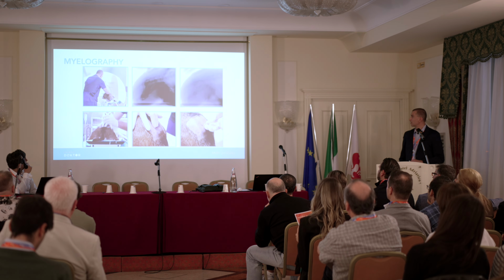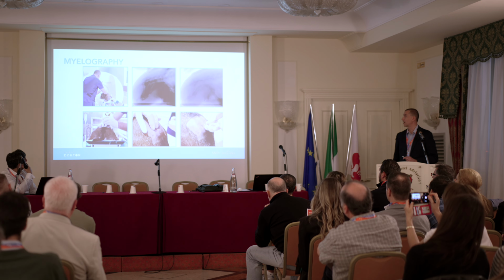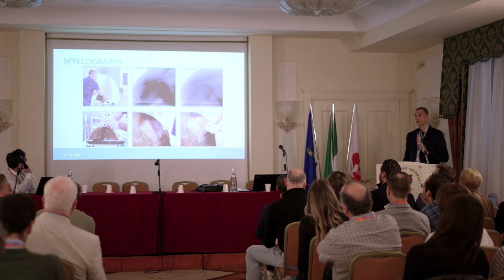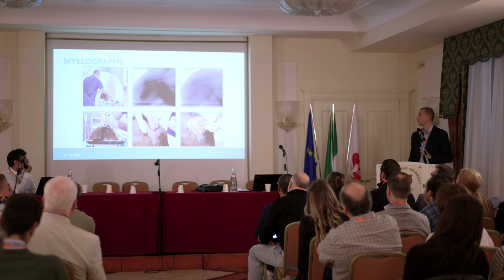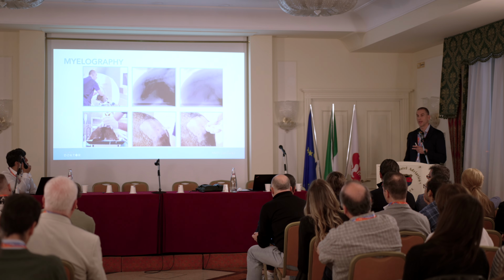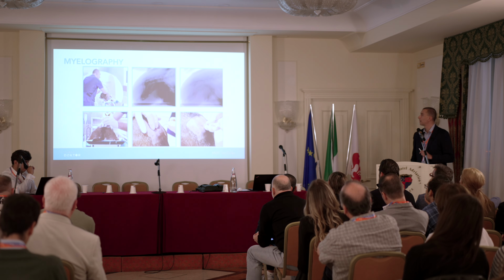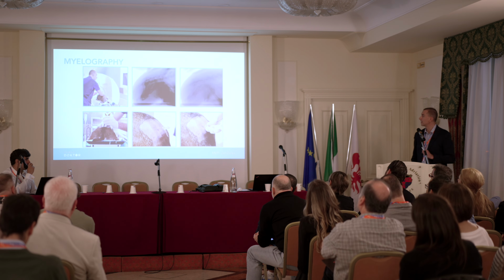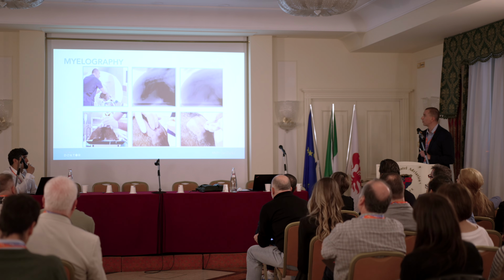So this was video just for this presentation, because to be honest, I don't perform myelo standardly on fluoro. For me, it's much more easy to get in, just palpate where I am and put the needle in. But here you can see some kind of application via fluoro assistance.